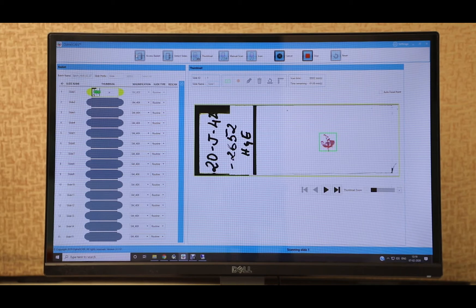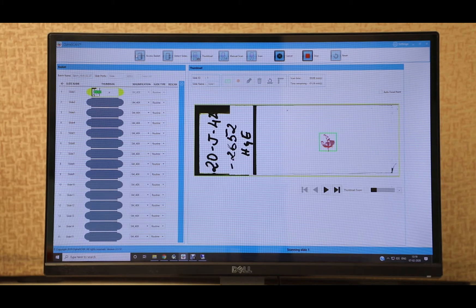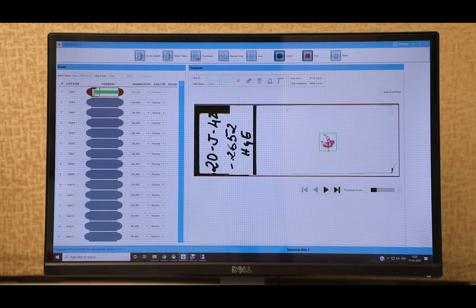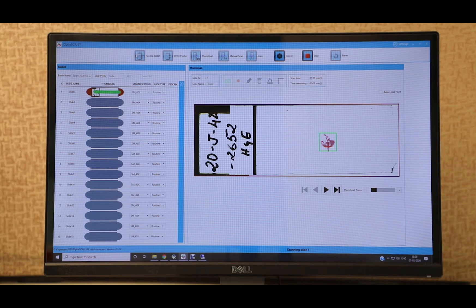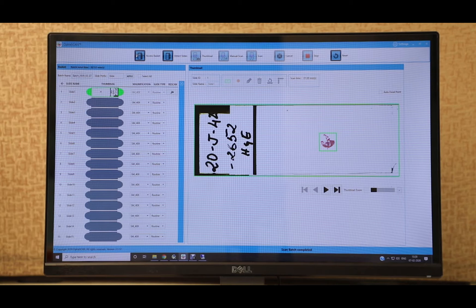Next, we have the actual scanning stage where the machine quickly captures tiny consecutive images. Finally, we have the post-scanning or encoding stage where these captured images are stitched together to produce the final seamless image.